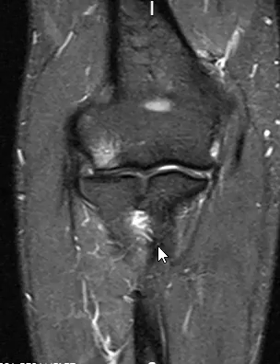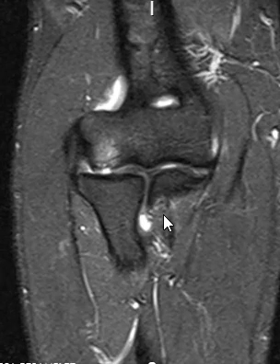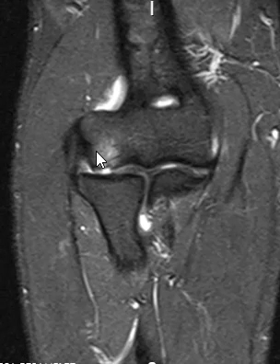And who knows, maybe there was an osteochondral defect here in his youth, and it just never went on to heal, and eventually dislodged. And so that is it, an osteochondral defect of the capitellum, a pretty common place to have an osteochondral defect.